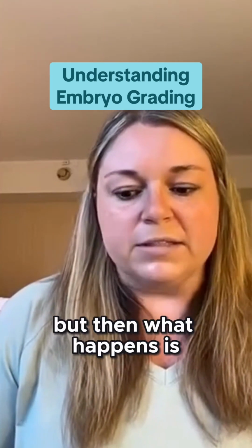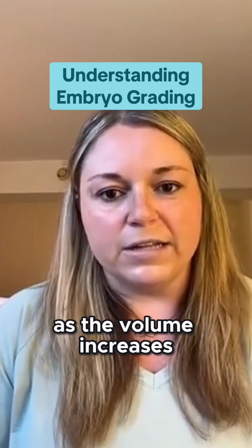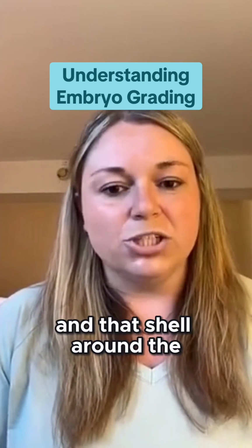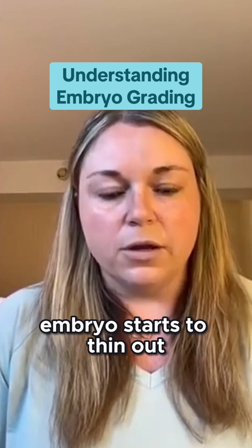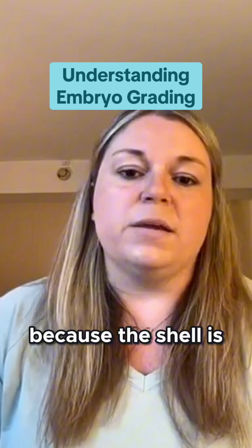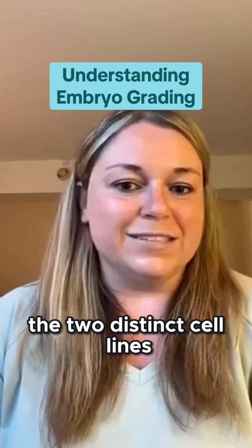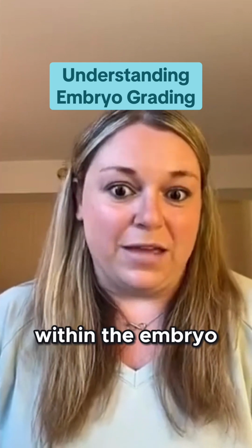But then what happens is the embryo actually starts to grow in diameter as the volume increases, and that shell around the embryo starts to thin out. And at this point, it's called a 4, or an expanded blastocyst, and we know that because the shell is very thin, and hopefully at this point you can see the 2 distinct cell lines that I'll talk about in just a second within the embryo.